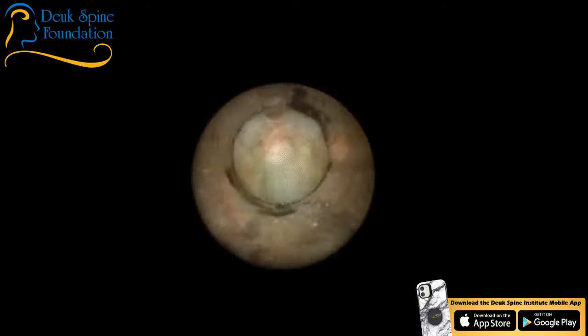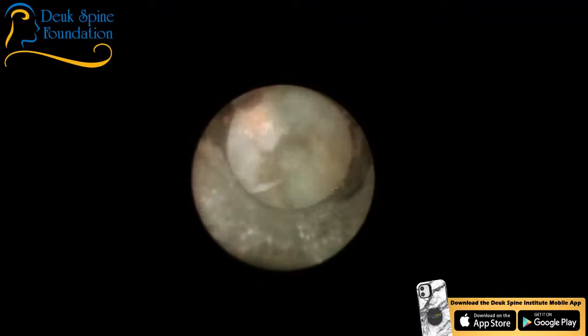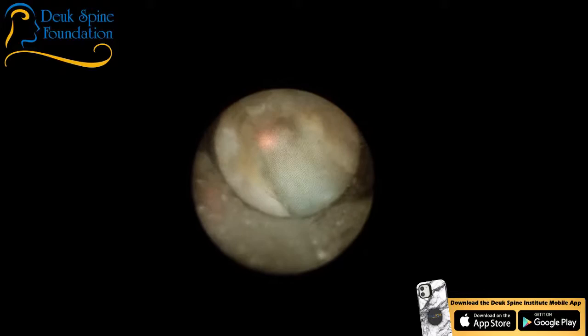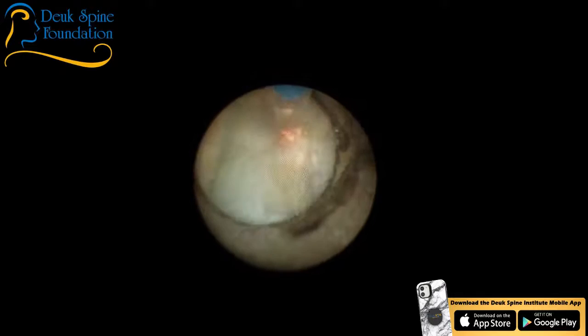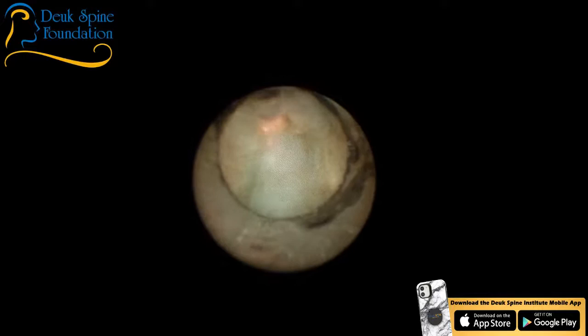You can see how bloodless the surgery is. I'm pulling my tube back a little bit and looking for any more herniation fragments in the back. We may clear everything out, but we don't want another herniation to go back into that area. I'm trying to get a little more lateral, just to make sure I have everything out of the foramen that's sitting on the nerve. A lot of this stuff is scarred in because it happened a while ago. I think we're just about done. If you think about the part pushed against the nerve as being the tip of the iceberg, this is kind of the base. We want to try to take as much of it out as we can, because our goal is to take the whole iceberg down so it doesn't push on the nerve anymore.